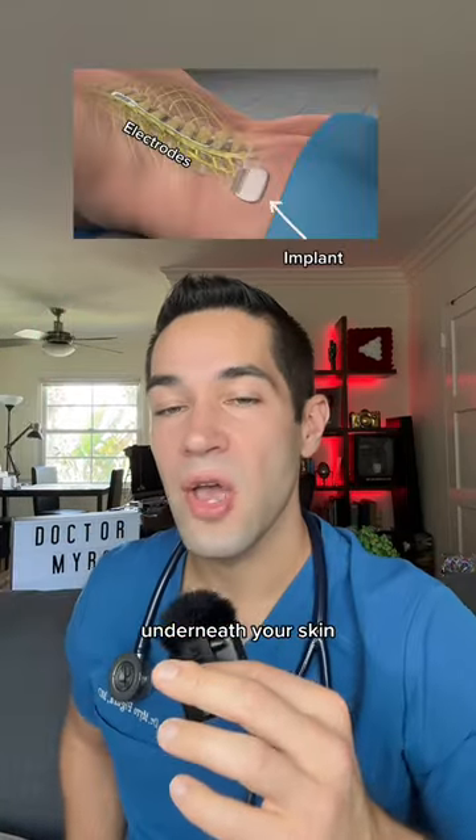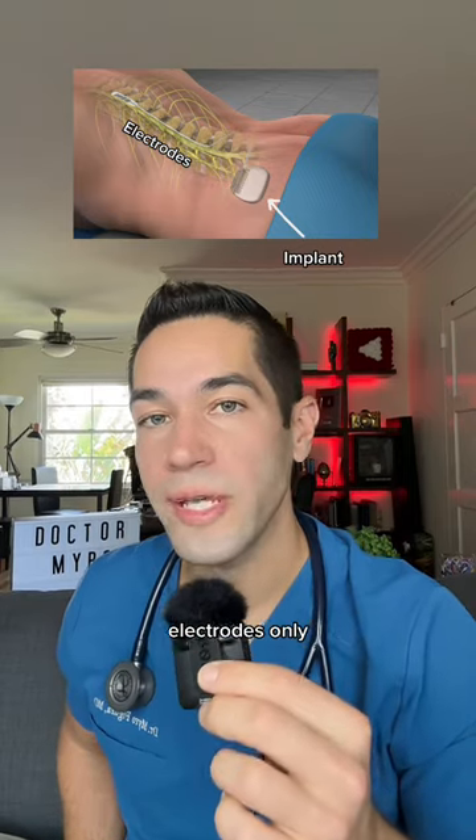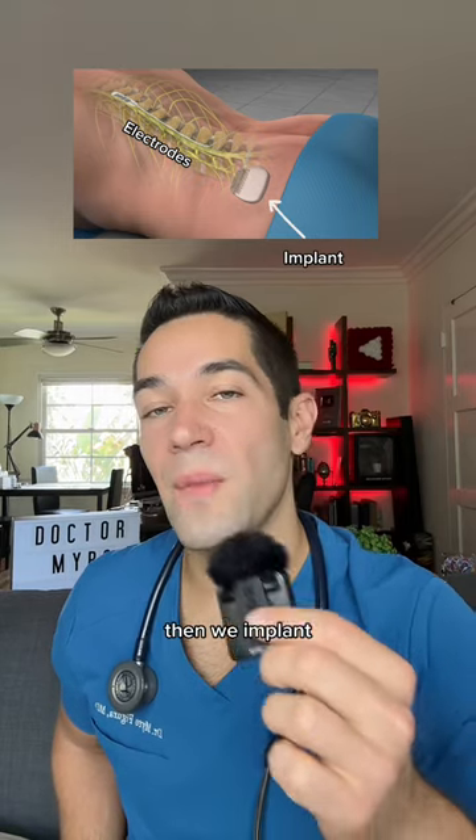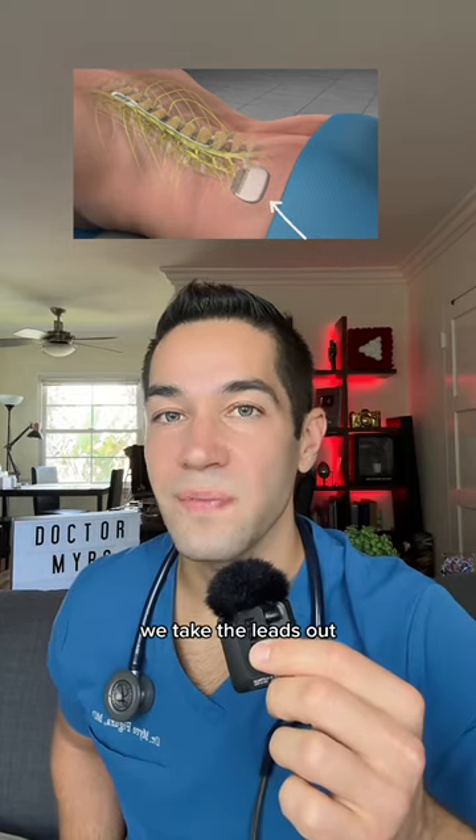So before implanting the whole system underneath your skin, we implant the electrodes only and use an external system to test to see if it works. If it does, then we implant a device, and if it doesn't, we take them out.